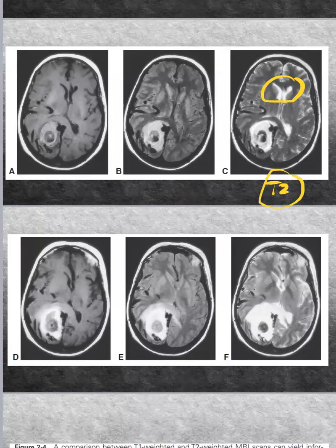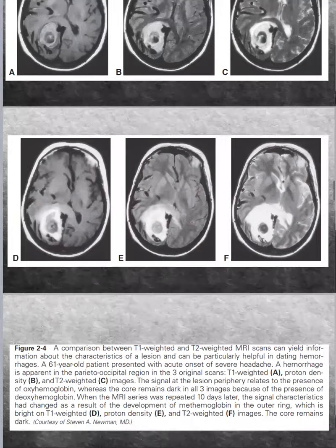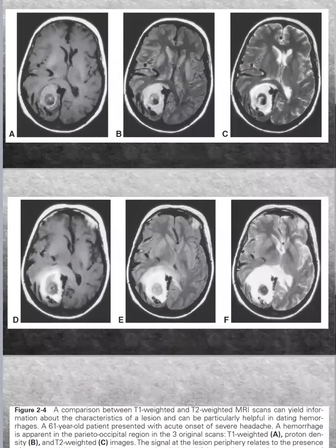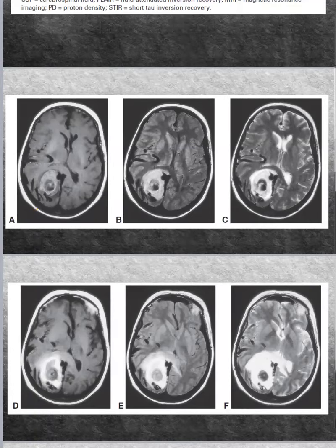And by the way, these lesions will be progressed to this level. These are the lesions after progression, so this is for the follow-up of some patient. By the way, to detect the lesion from the start, the FLAIR is extremely good. It may be misdiagnosed. Here it is obvious and striking, but it may be misdiagnosed if it is small and I use just T1.